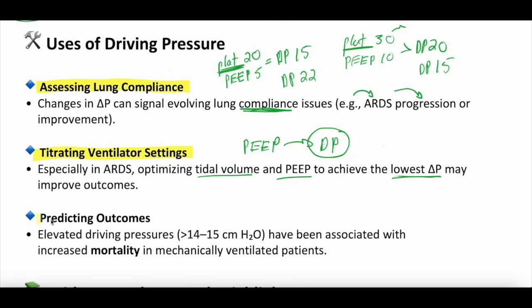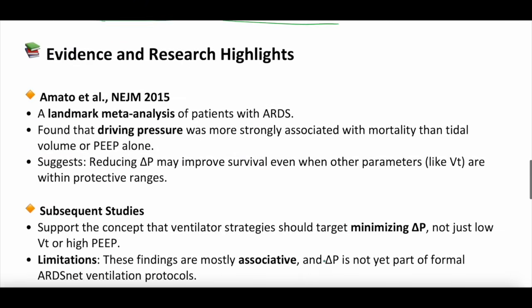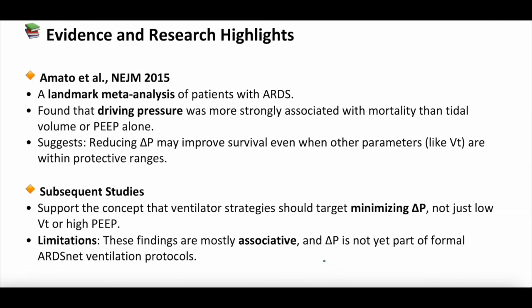And then predicting outcomes, we don't use this as much, at least personally, but elevated driving pressures are associated with increased mortality in mechanically ventilated patients. So if you were to think a little bit about the evidence, this is just as of this video recording, there's certainly other evidence out there, but in 2015 New England Journal of Medicine, there was a landmark meta-analysis of patients with ARDS, and this is when driving pressure kind of came more so into the forefront. And it found that driving pressure was more strongly associated with mortality than even tidal volumes or PEEPs. So it suggests that reducing the driving pressure may improve survival in these patients with ARDS.